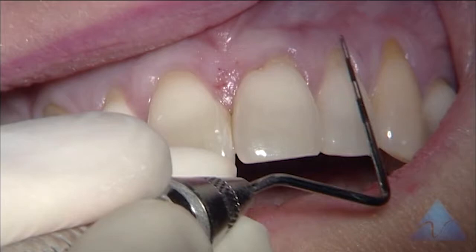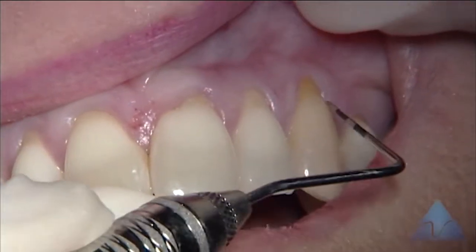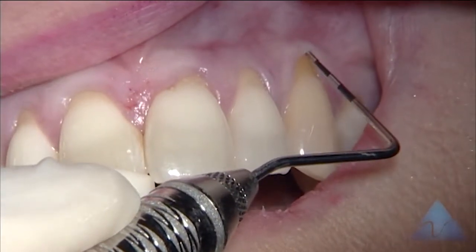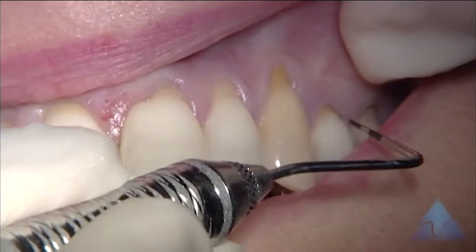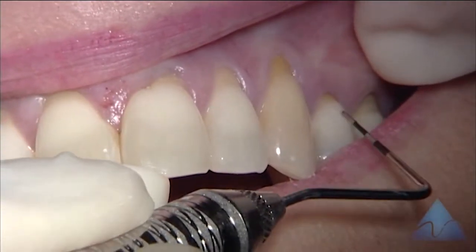On the lateral incisor, we see three millimeters of recession. On the canine, probably two millimeters, with no attached gingiva on the canine. The premolar behind it is good — a good zone of gingiva and good thickness of tissue, so it's not involved.